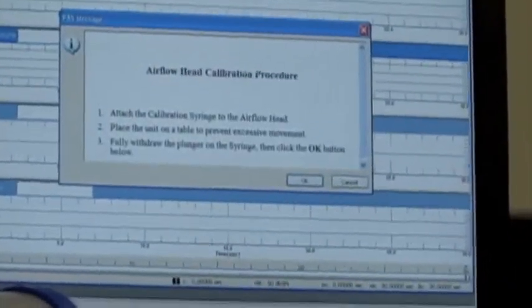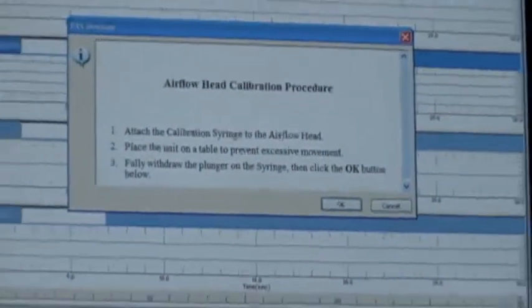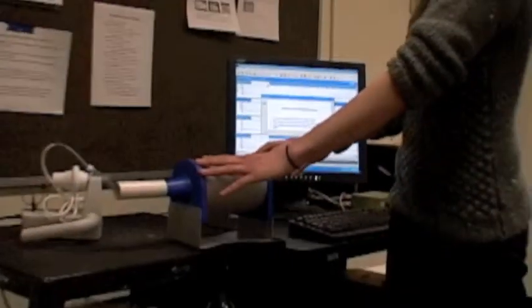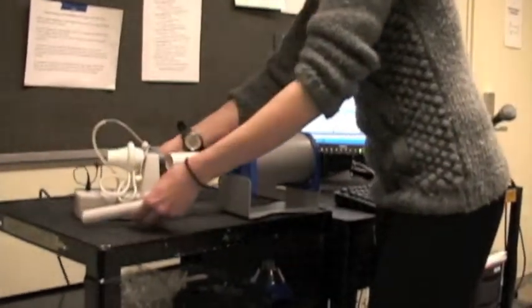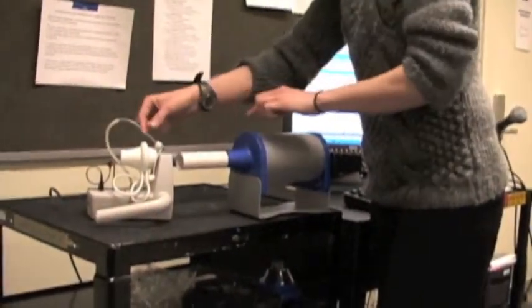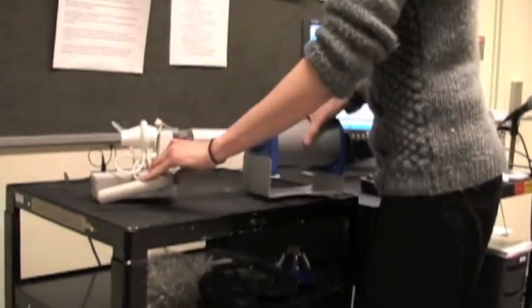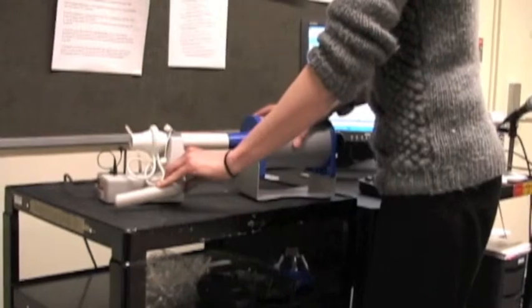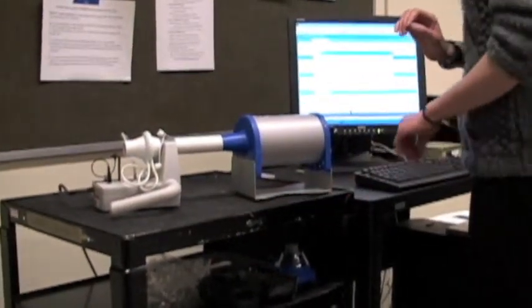It's going to bring up a series of instructions. First thing, attach the calibration syringe — which is this thing here — to the airflow head. You're going to make sure you remove the intraoral tube if it's still in place, and attach the syringe to the handheld device. Place the unit on a table to prevent excessive movement.